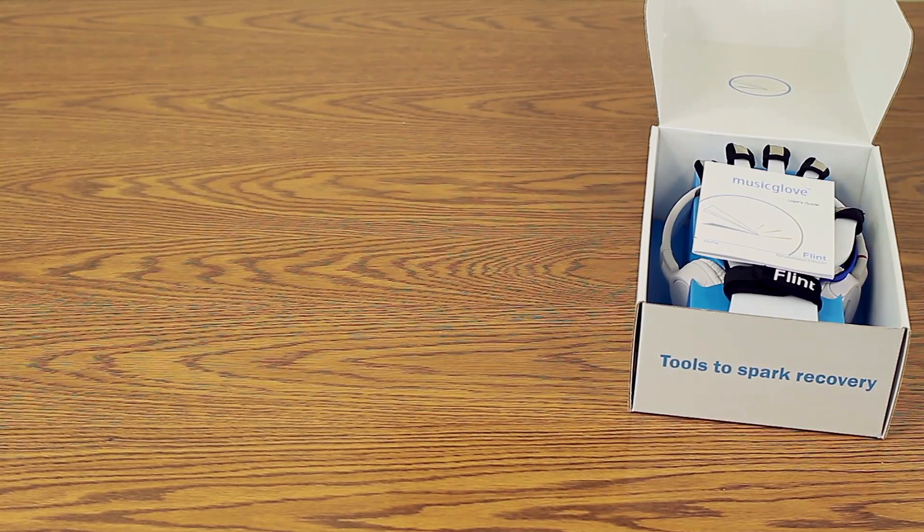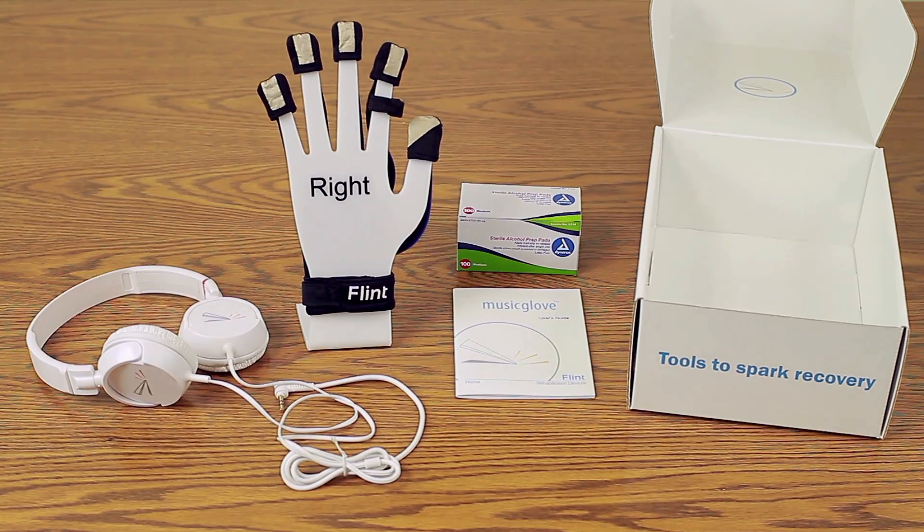Here you will find the user's manual, MusicGlove, headphones, and alcohol wipes.